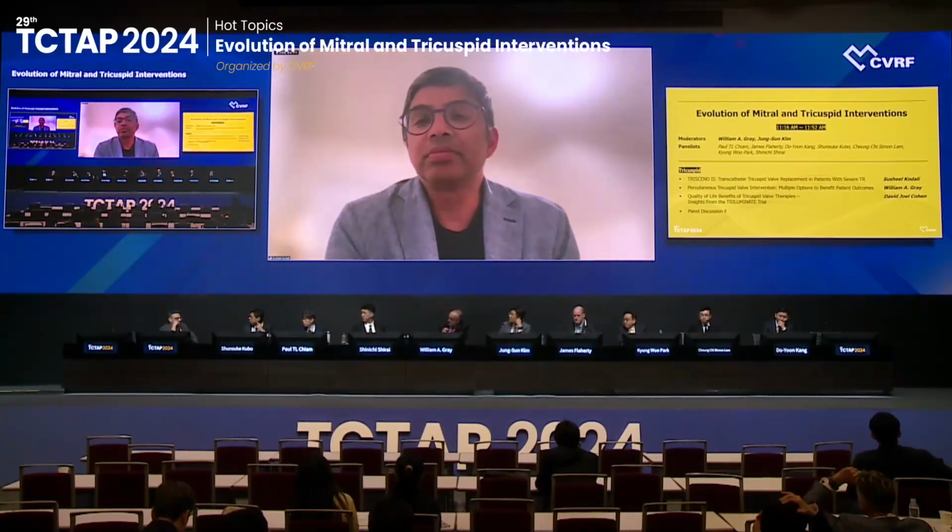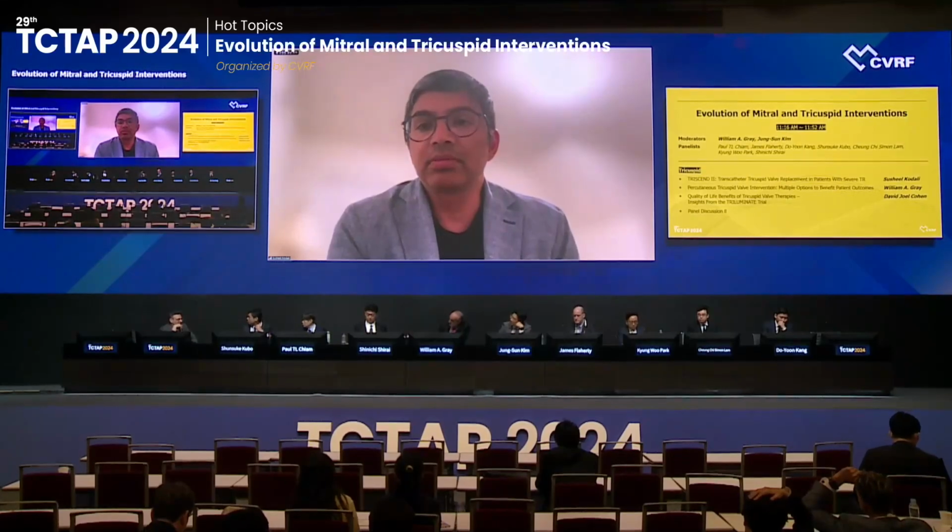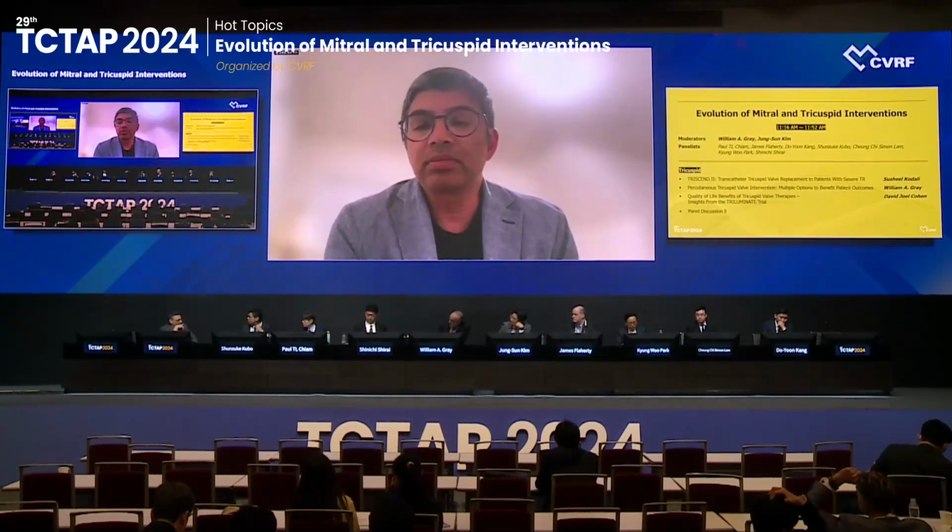David? I'm going to largely agree. Anatomy is going to dictate a lot, and RV function are the two main parameters that we're going to look at. I think just given the incredible safety of TEER, you could put forward that it should be perhaps the first line if you think you can get a good result, because of the tremendous safety record. But there aren't that many patients in whom you can get those exceptional results, and in those I think we have to be willing to go to a valve replacement technology, and fortunately we have one of those as well. But I do think the anticoagulation is a barrier.